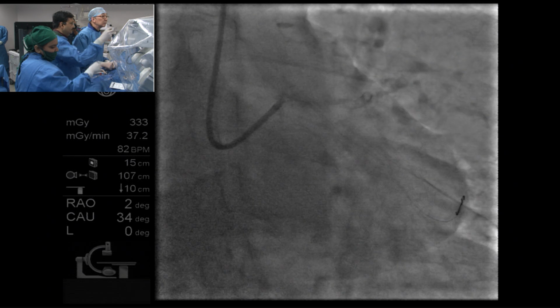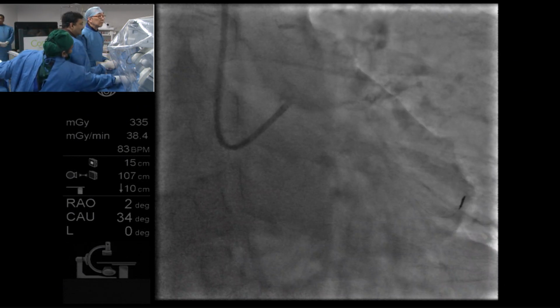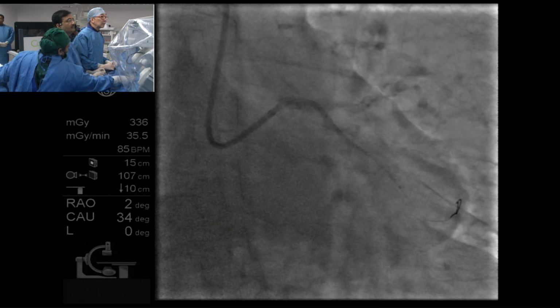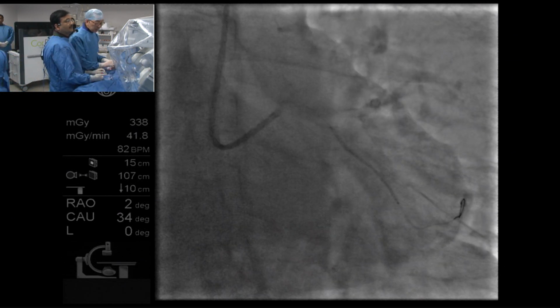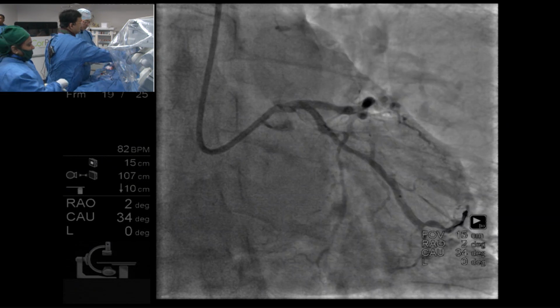No, if we don't want to give the RFR, it will definitely be helpful. It will be quick. Perfect. Okay, go. Picture. Yes. Fine. Okay, looks good. All right, let's go.